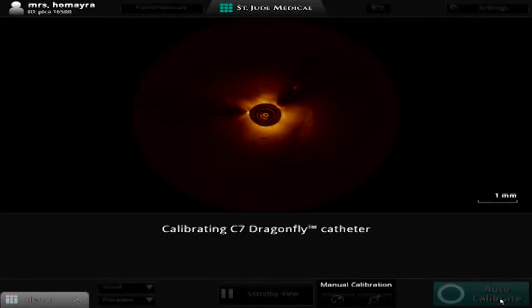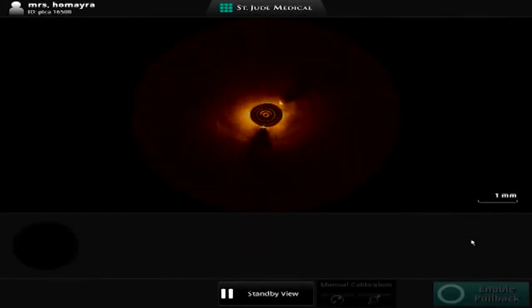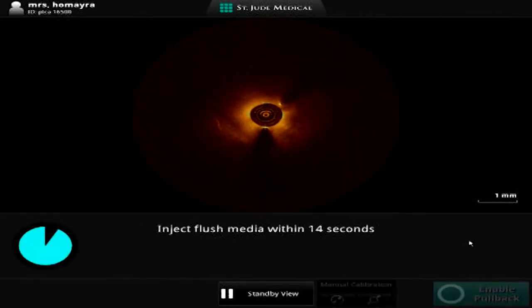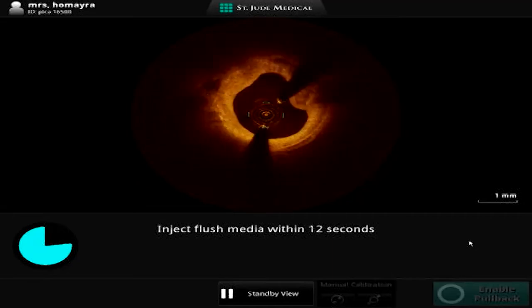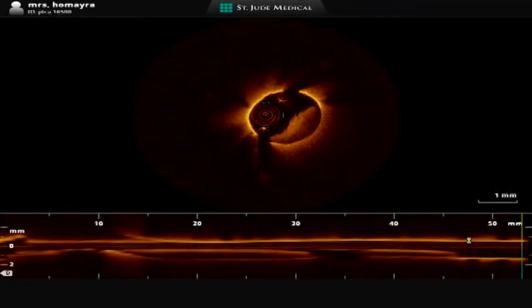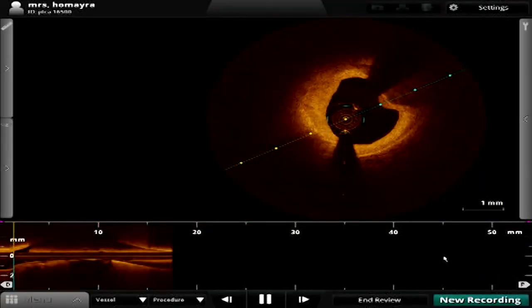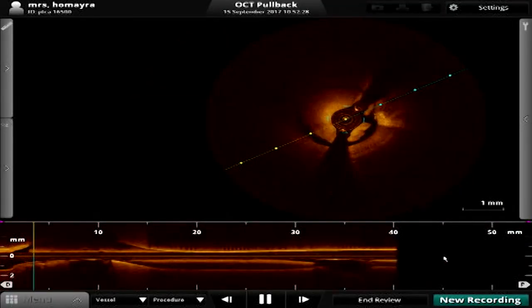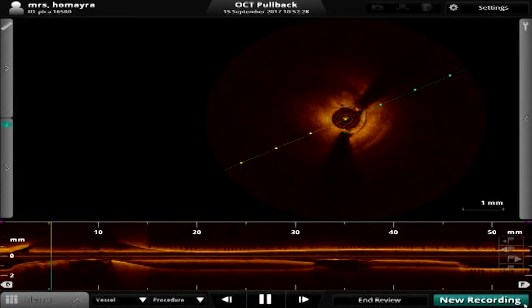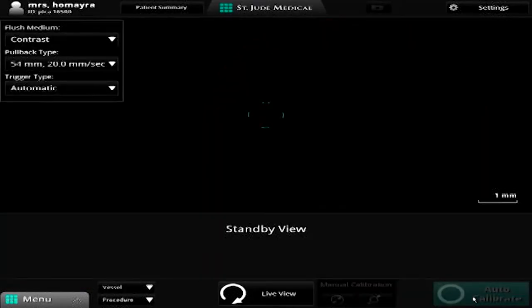But still, just ballooning is a good option as well. Can we have another shot, please? You have to save an after. Should I record it?